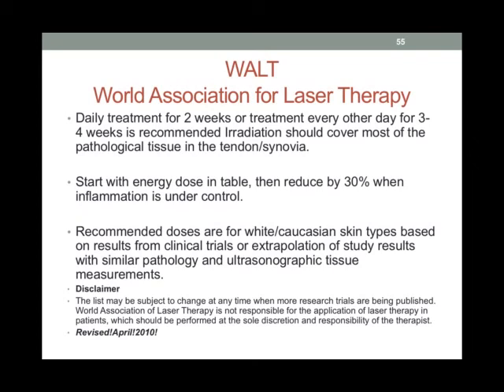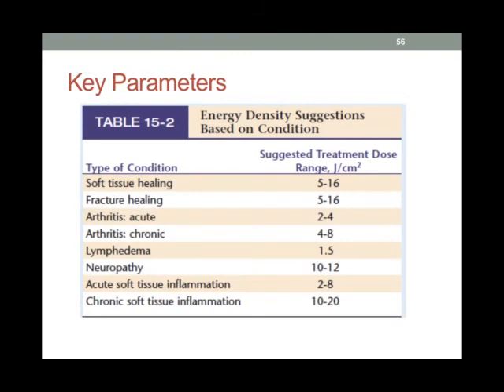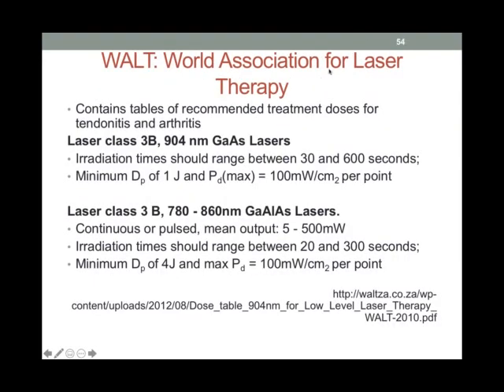But for somebody who has more melanin in their skin, what is recommended is that the dose is actually increased.